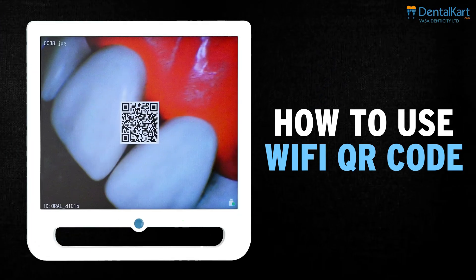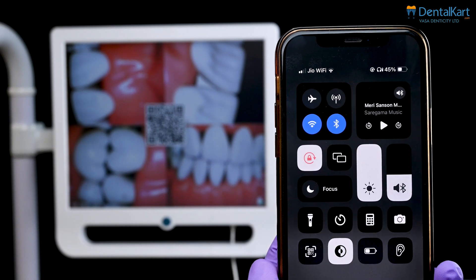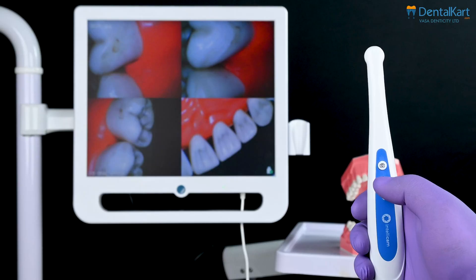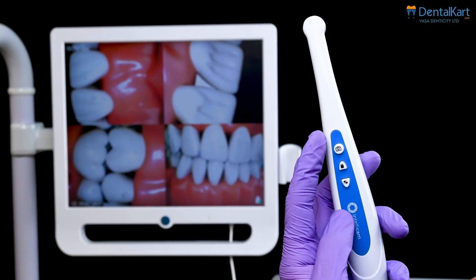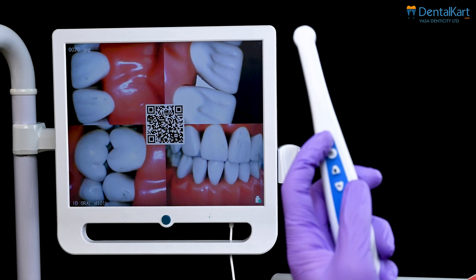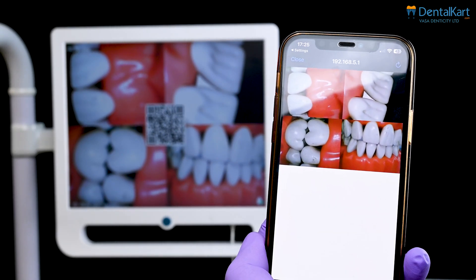How to use the Wi-Fi QR code. Open the Wi-Fi settings on your mobile phone and connect to the signal with the same name as shown in the lower left corner of the screen. Enter photo browsing mode, select the photo you want to save to your phone, and press and hold the one/four screen transition button until the QR code appears on screen. Scan the QR code with a mobile browser to view the photo, then save it with a long press.